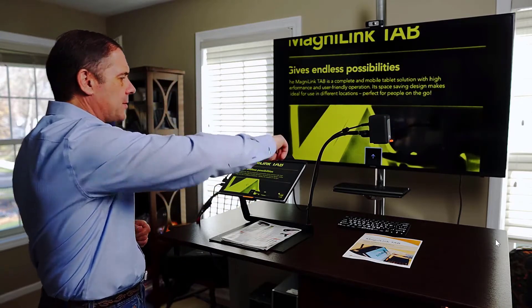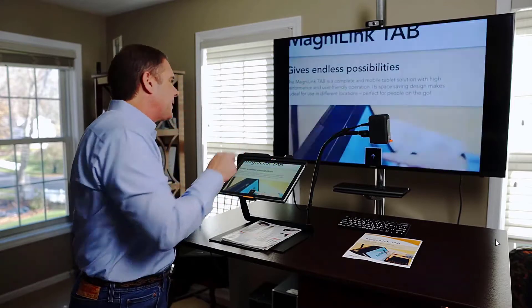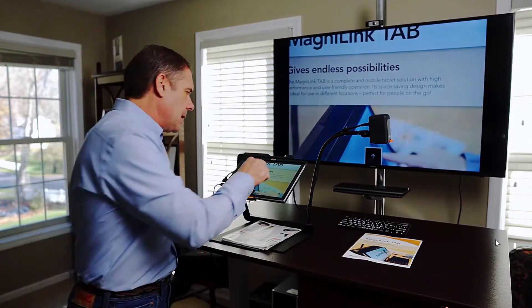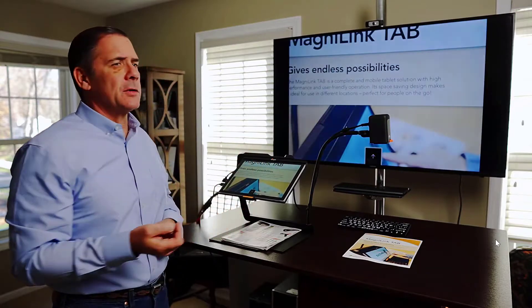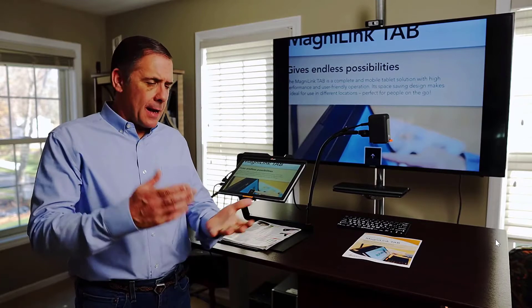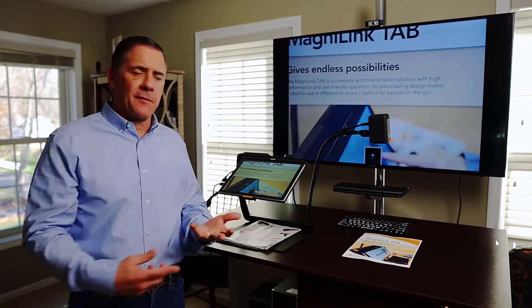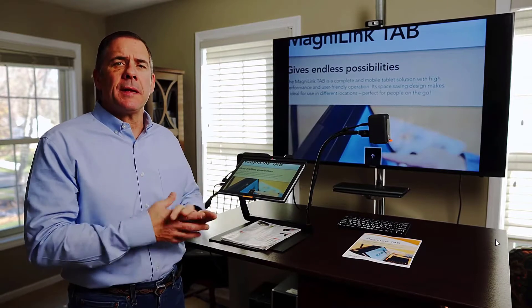I can change the brightness by moving left and right and up and down. To jump right back to color, I use two fingers and I'm back to color mode, then right back to where I like to read. It's very productive and quick. Now that I have my best reading magnification, I can jump around, read, switch modes, and really get the most out of it.